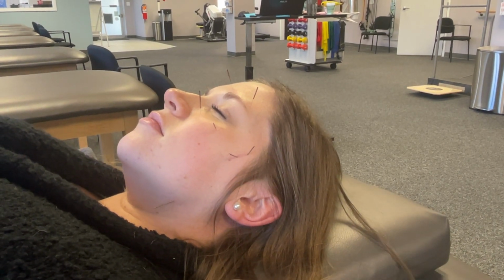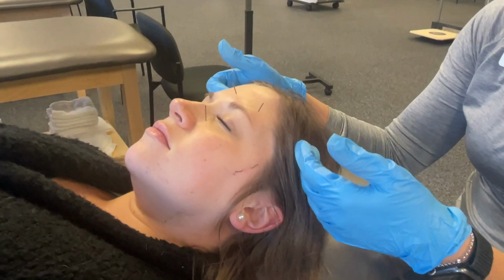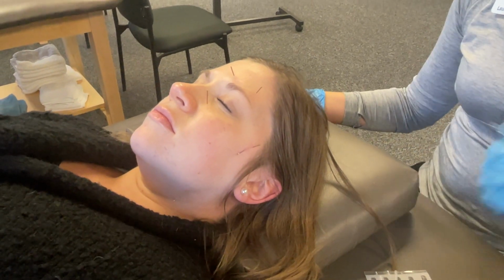And then say she were to have some more tension-based headaches along her temporalis bone, we could put some needles here as well. There will be video content of this on our YouTube page.